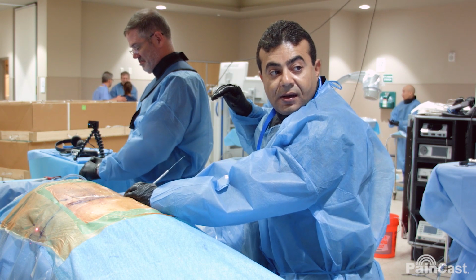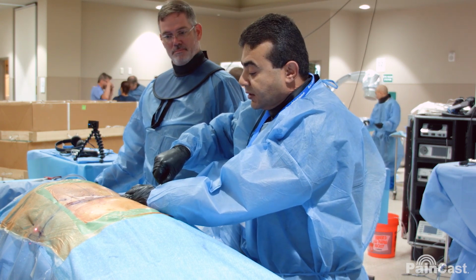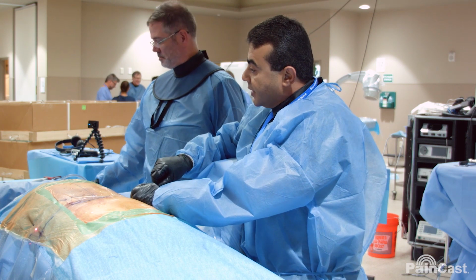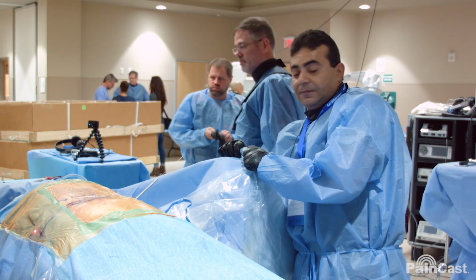X-ray. So we see how we are on a lateral view. We did not cross. X-ray again. I'm feeling the facets. I'm going through the facets. Let's square off the end plate a little bit.